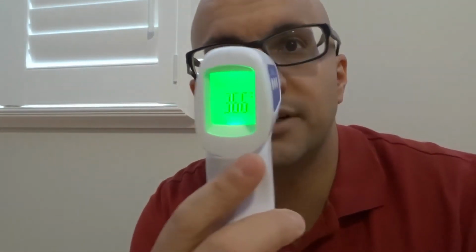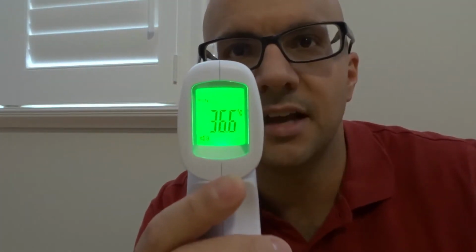So once again, you just place it close to the person's forehead if you want to measure their overall body temperature. Okay, you press and hold the button down, release it. And once again, 36.6. If you turn the volume on, you will hear a beep. I'll do it one time. So I'll turn the volume on right now. Okay. And do the same thing, just like that. And it's been measured already, just like that. Once again, 36.6 degrees Celsius.